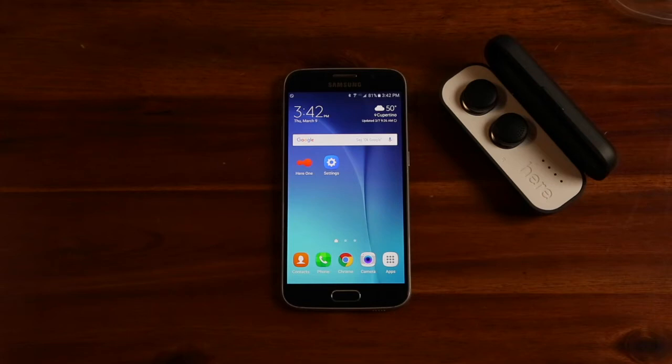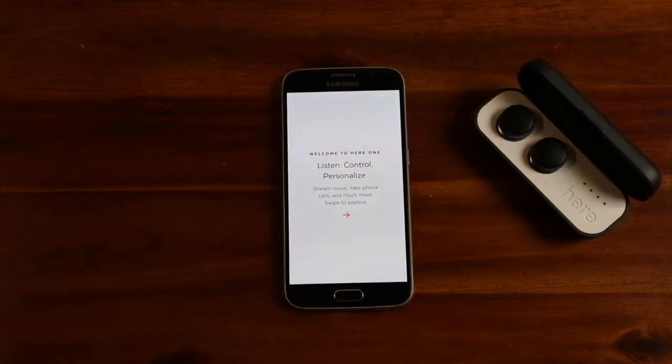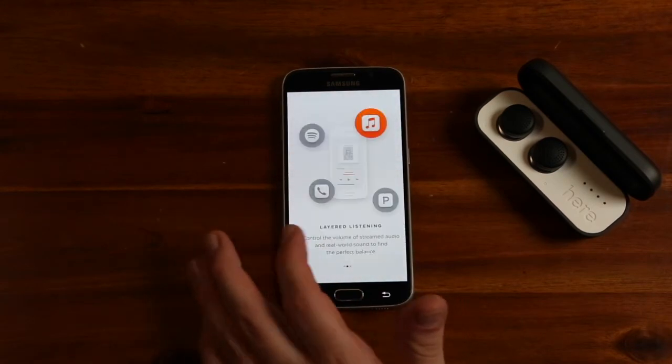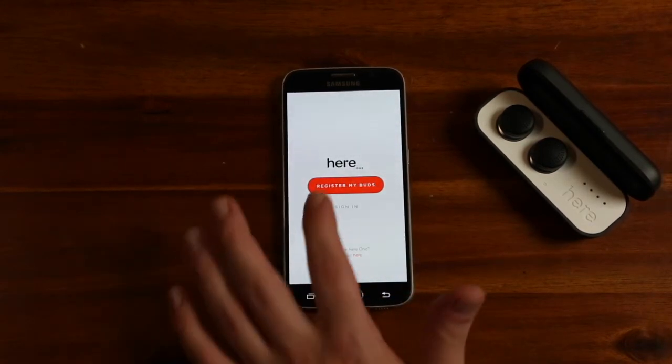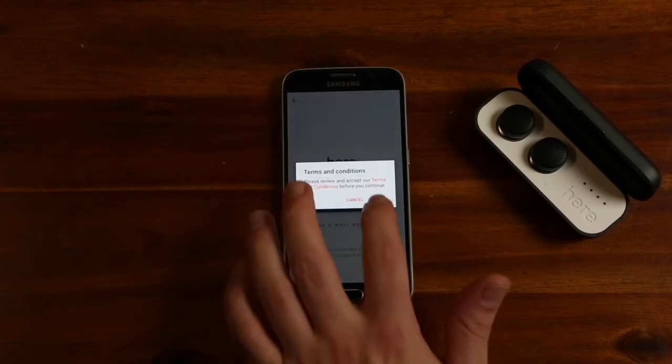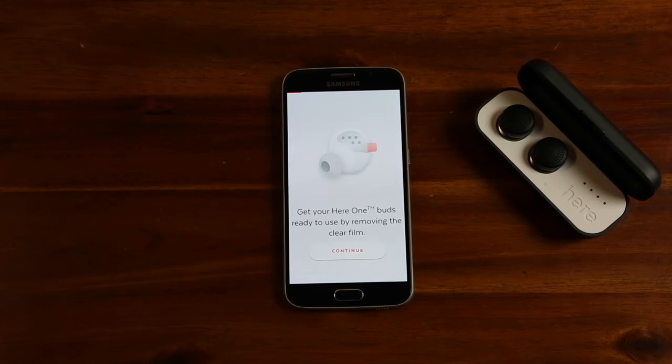If you haven't already, please download the HearOne app from the App Store. Once installed, open the app. You will see a few screens explaining the great features of HearOne. Then you will need to register HearOne. This will activate the warranty and enable important product updates in the future.